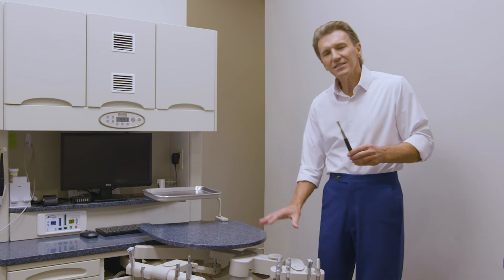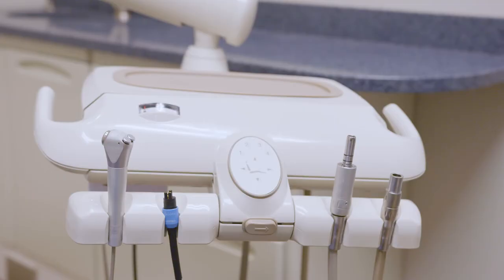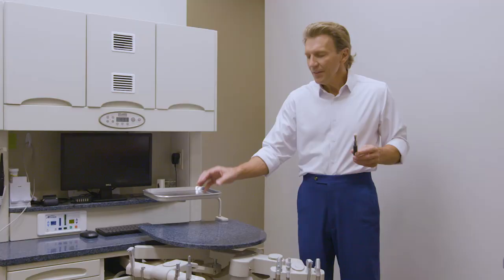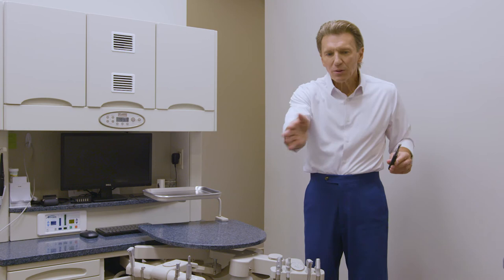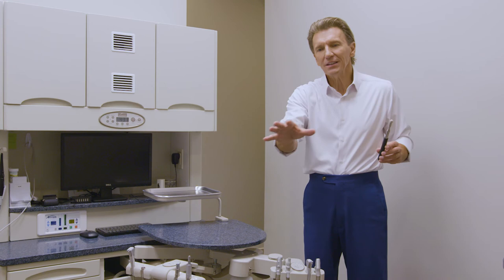One advantage is that the doctor's module, which contains your hand pieces, is no longer in front of the patient where they can view it. Pediatric dentists especially love this option — they don't want kids to reach out and grab a hand piece or even see them. The second huge upside is that the pathway on the right side of the chair, where I previously had to pre-position the doctor's module to reach the sink, is now completely clear, which is a big advantage if you're bringing in mobile units.